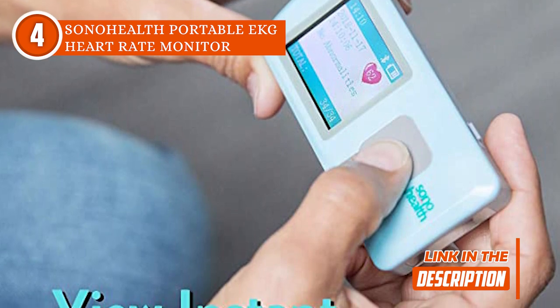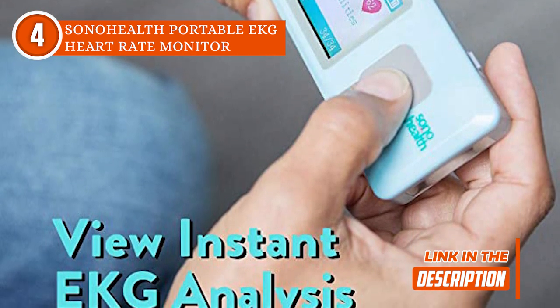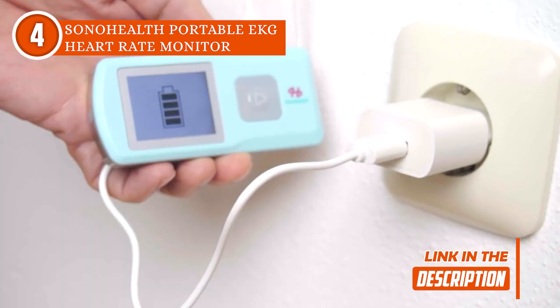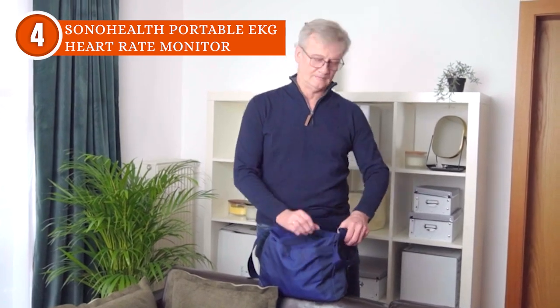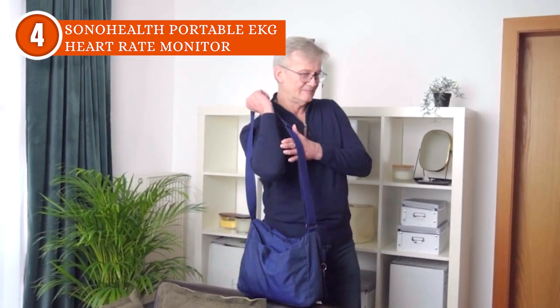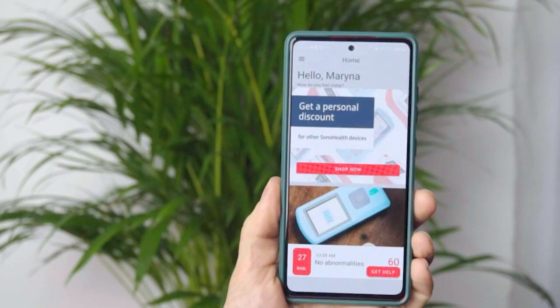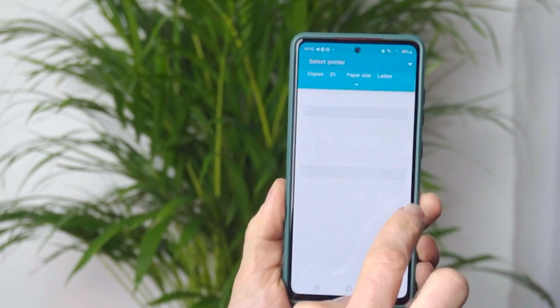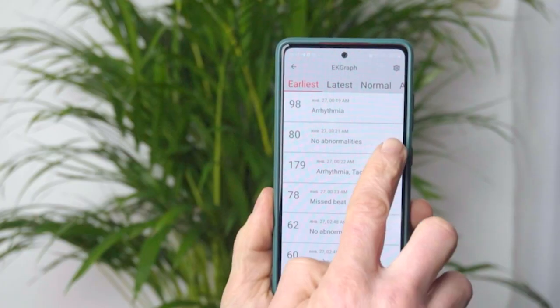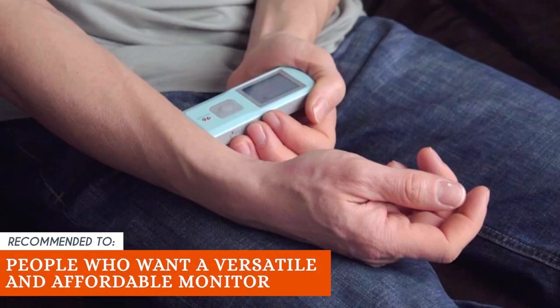The team also really liked that it has EKG graph sensors that can pick up on important warning signs to give an accurate result. Because it's small and light, you can easily put it in your pocket and bring it with you when you walk, drive, or go to the office. Even though the SonoHealth app works with a lot of different devices, it has some trouble maintaining a connection for a long time, meaning you would have to reconnect every now and then. The Trusted Shopping Guy team recommends this for people who want a versatile and affordable monitor.